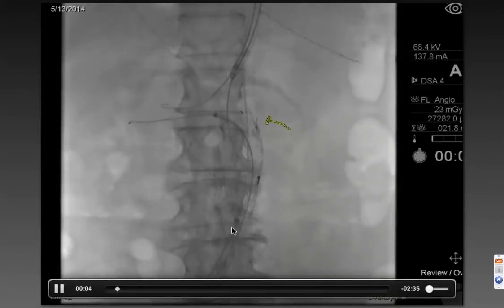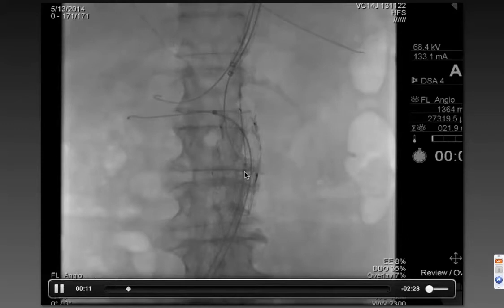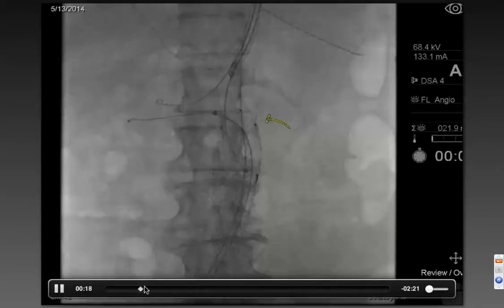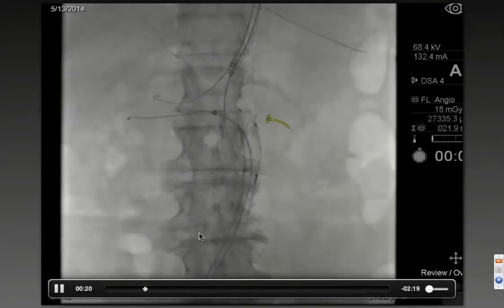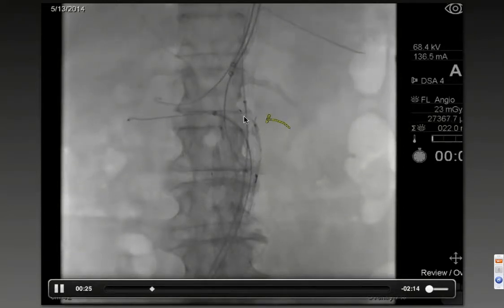So what we did in this situation — what you're going to see is the robot coming up here. We have the three components: we're going to have the wire and the leader. The leader is barely outside the end of the sheath. I'm advanced up over the wire in traditional fashion. Now we're going to bring the leader up. Typically, we will bend that sheath away to give us some working room for the leader catheter.